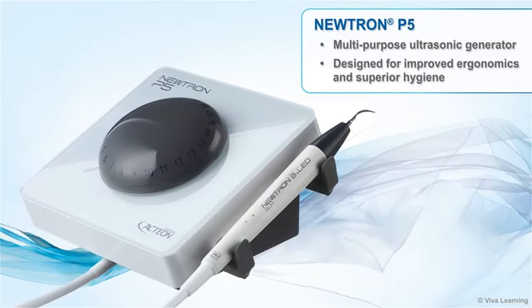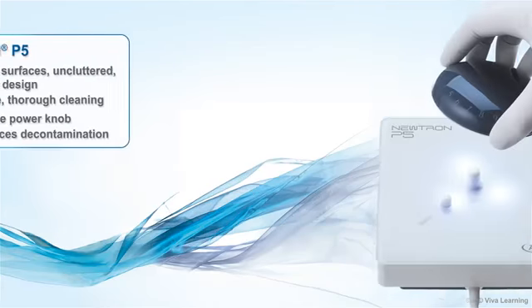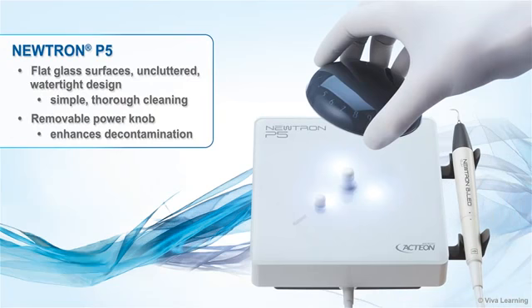The Neutron P5 is a multipurpose ultrasonic generator designed for improved ergonomics and superior hygiene. The inclined front panel provides better visibility, easier access to settings, and effortless interaction with the practitioner. Its flat glass surfaces and uncluttered, watertight design allow for simple, thorough cleaning. The removable power knob comes off easily to enhance decontamination.